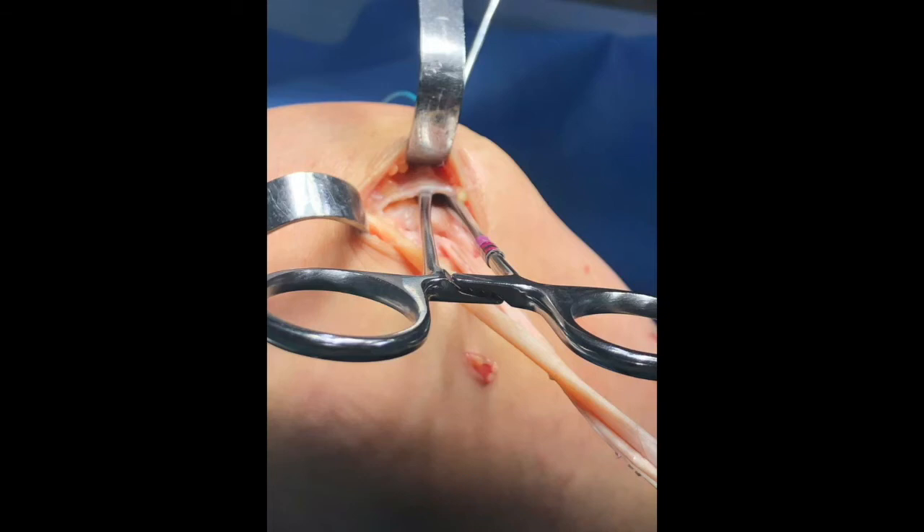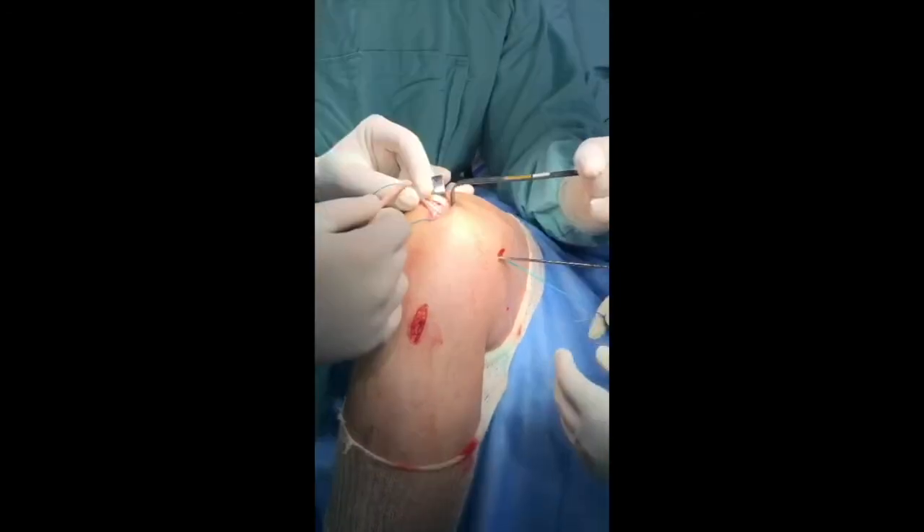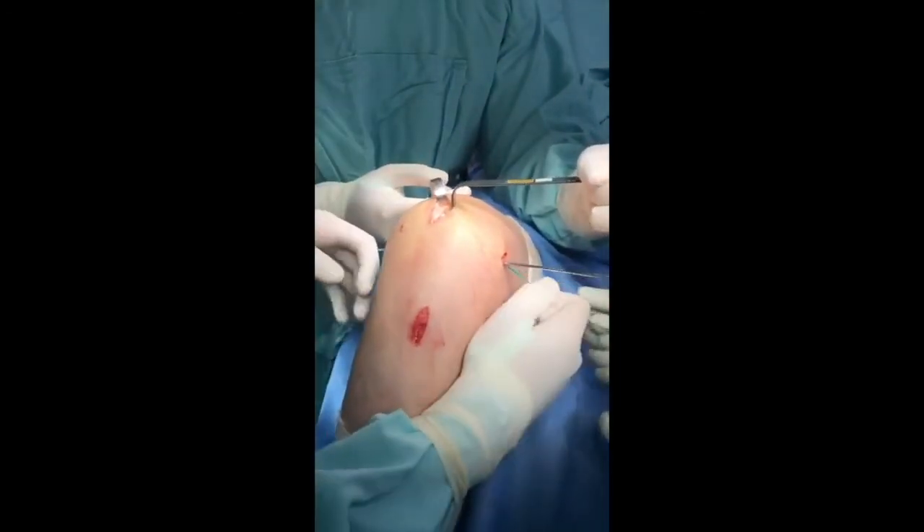A suture shuttle is used to pass the graft deep to vastus medialis, between the second and third layers of the knee. The graft is retrieved through the medial femoral incision and then passed into the femoral socket.